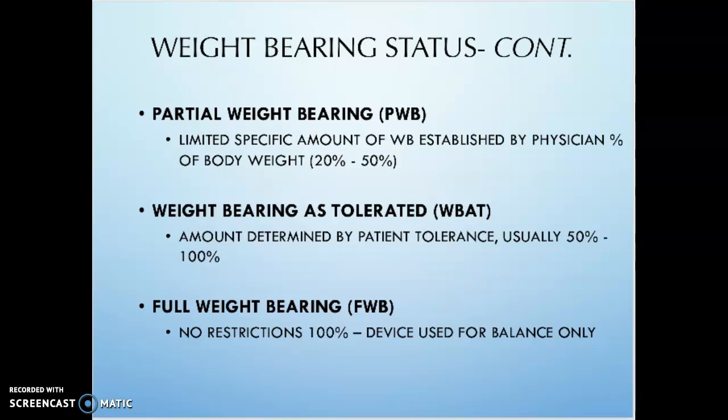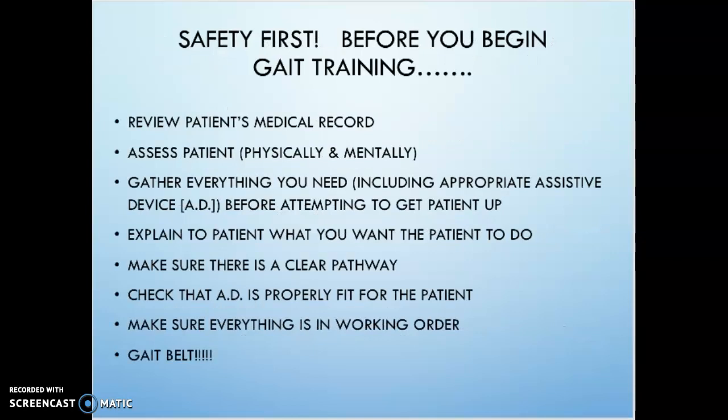So before we begin gait training, obviously there's a lot of information we want to know. Of course, cognitive status is critical with many situations where we are teaching patients important information. They need to have the ability to follow instructions and remember what has been taught to them.